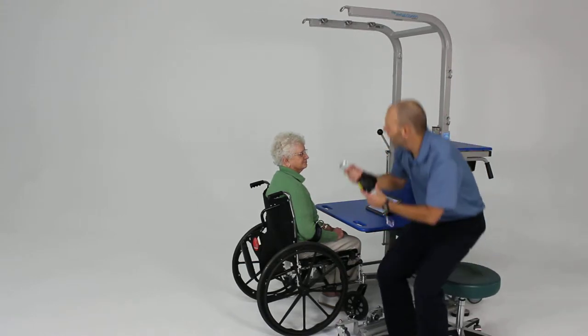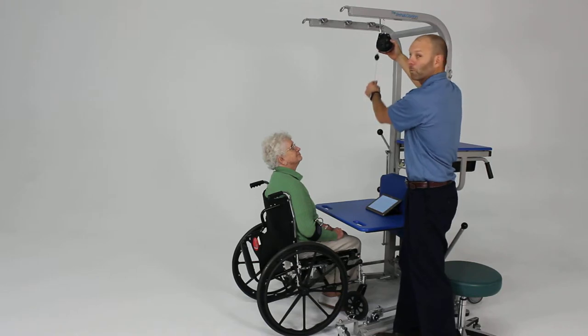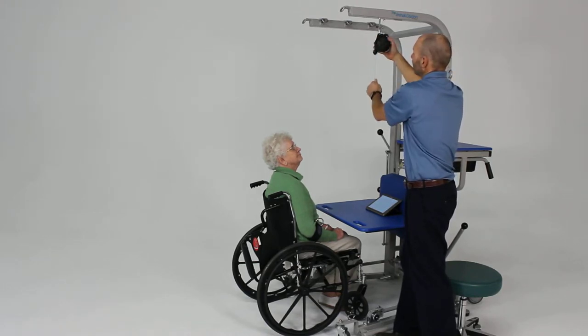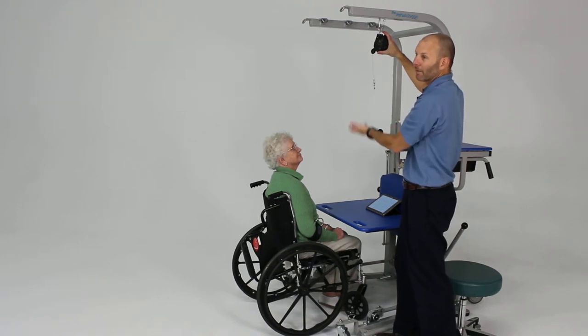We're going to take that and hook it up to one of the upper hooks. We can adjust the amount of tension or support provided by simply turning the dial clockwise to add more support or assistance, or press the silver button to release more of the tension and provide less assistance.